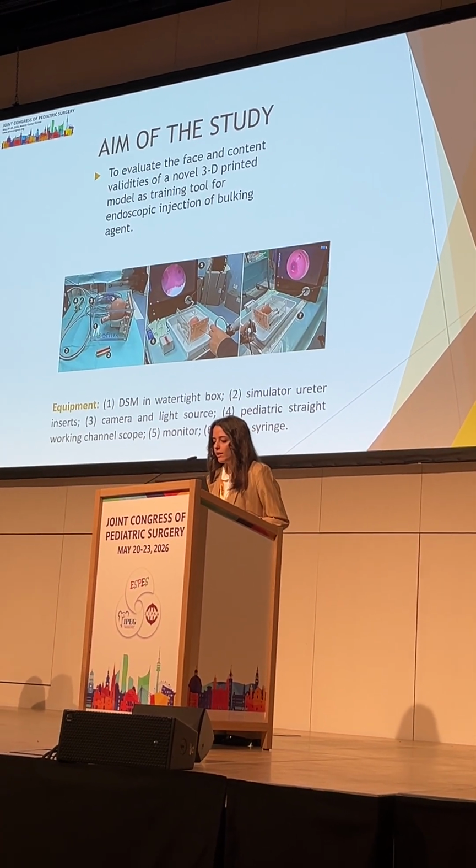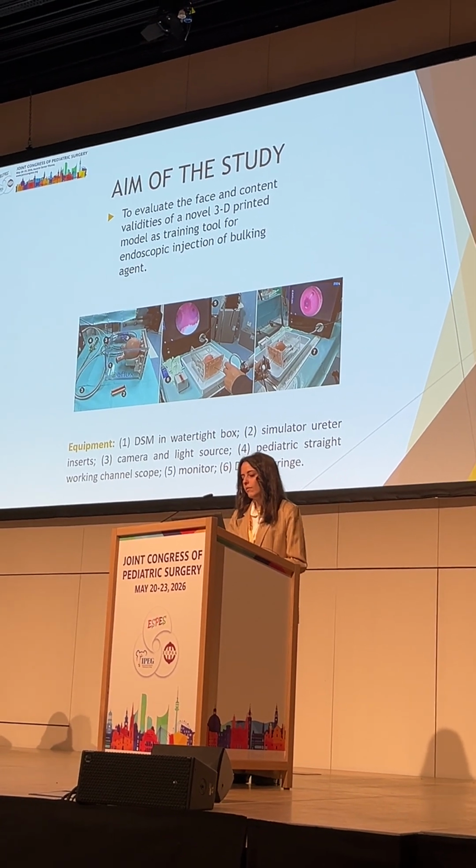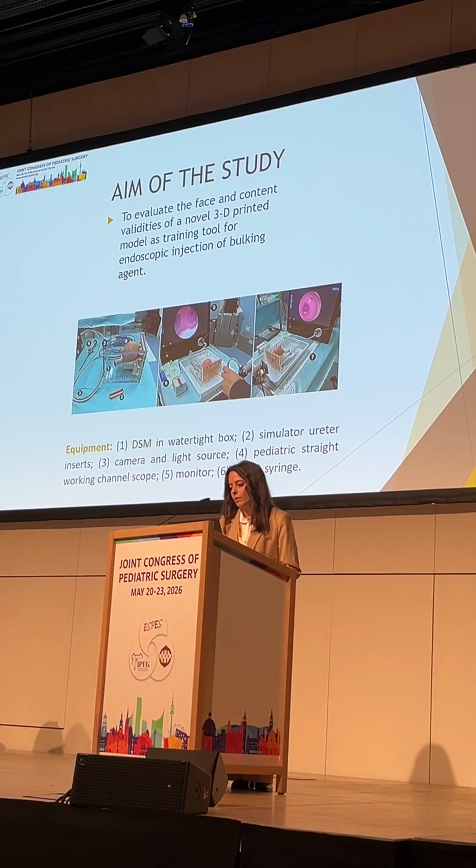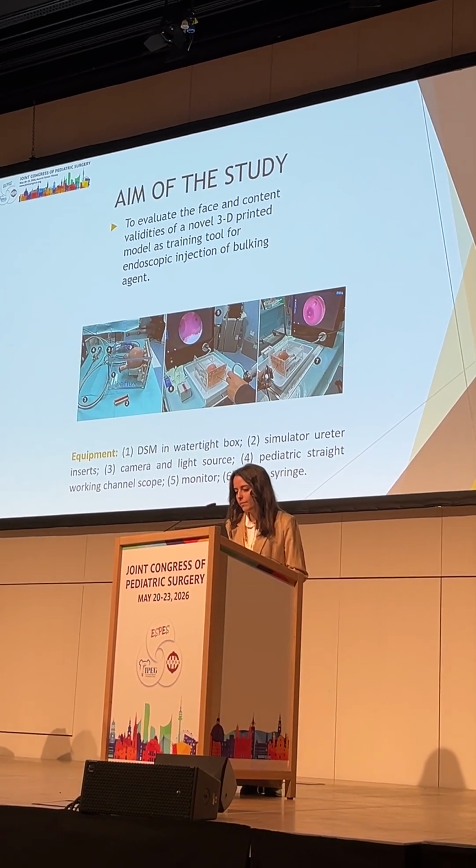The study we conducted aimed to evaluate the face and content validities of a novel 3D printed model as a training tool for endoscopic injection of bulking agent.